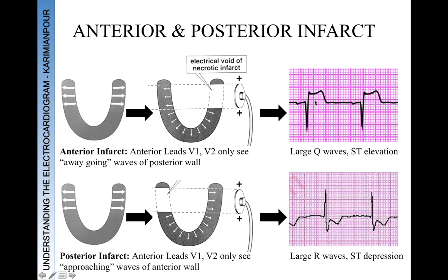So it looks like an anterior infarction. So when you do the flip mirror test and it looks like an anterior infarction, then it is definitely a posterior infarction. So these are some things to keep in mind.